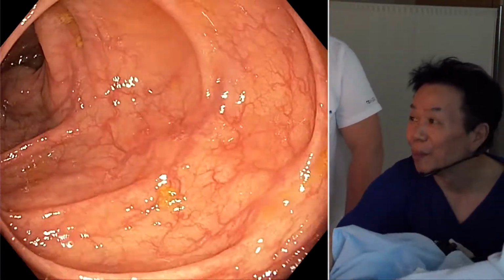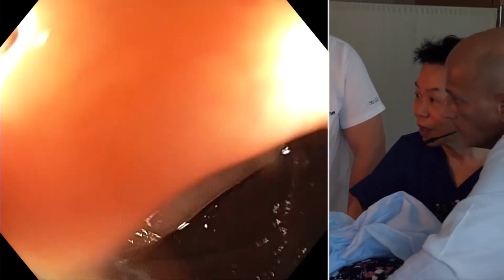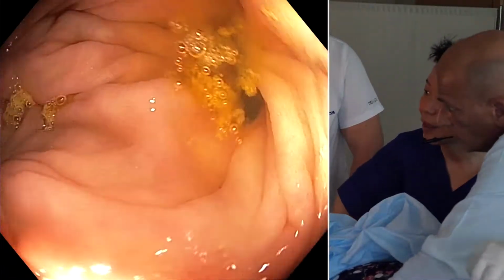Oh, very big belly. So would you hold the belly like this? I should have started with the prone position. Prone position can make it very easy.